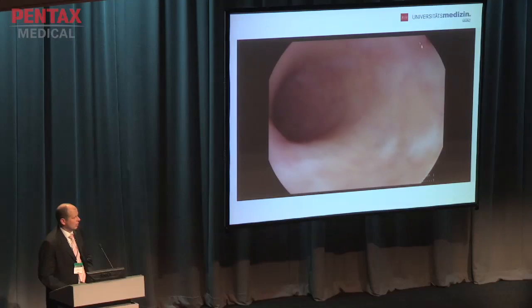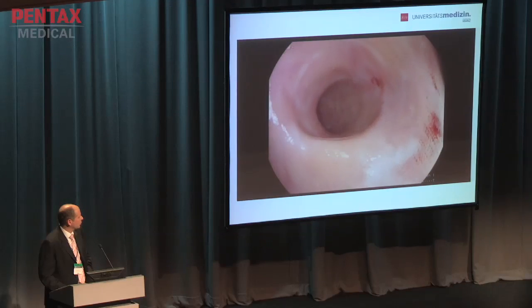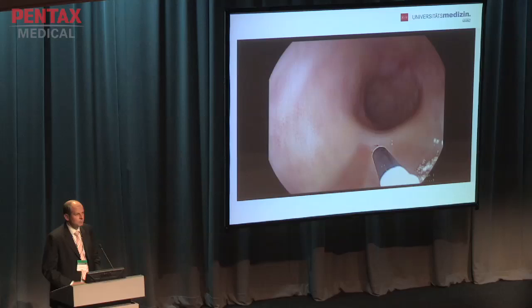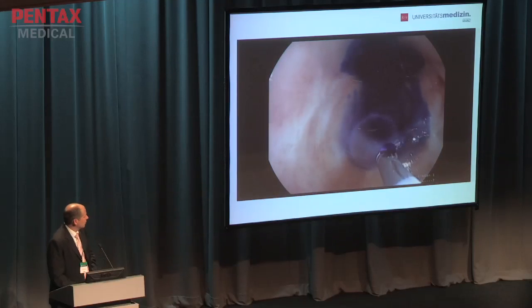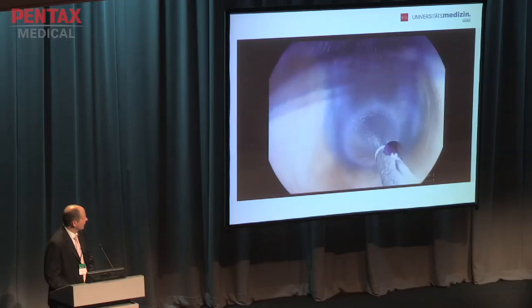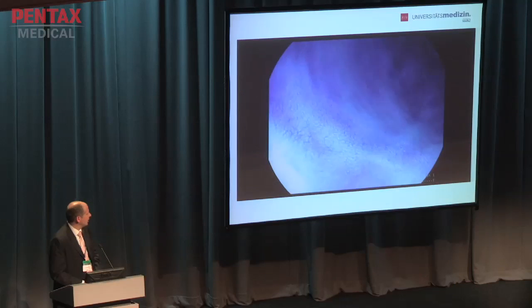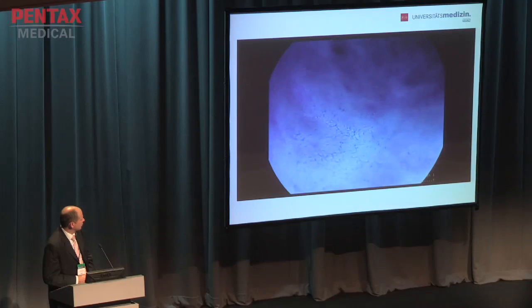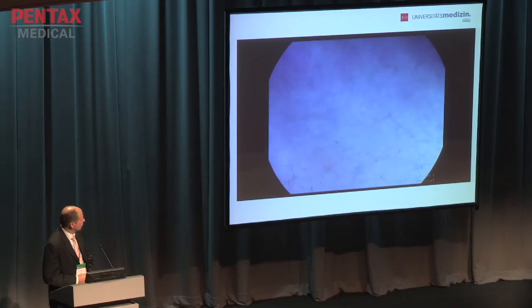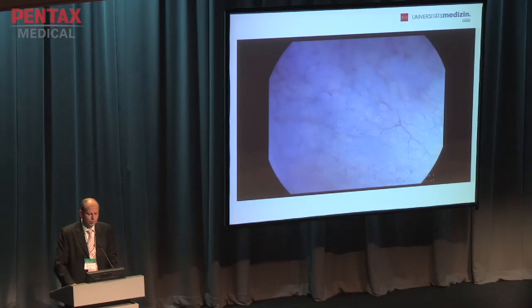And that is another case. You see here the rectum, a patient with long-lasting ulcerative colitis. There's no lesion visible, but now we use chroma endoscopy to further define the mucosa. I like to use methylene blue in a final concentration of 0.1%. Here it is done in an untargeted fashion, meaning that this whole segment is stained. And immediately, even before it is absorbed, you can have a view onto the mucosa. And here I use the zoom colonoscope, and you can see the normal colonic crypts very nicely. And still the vasculature can be seen if you use that diluted methylene blue.